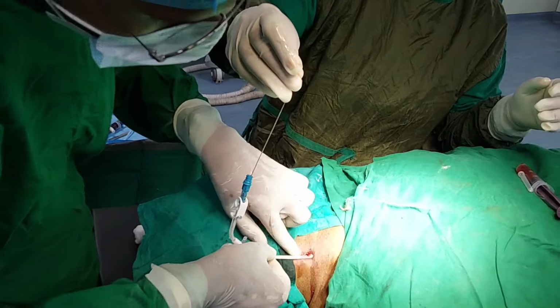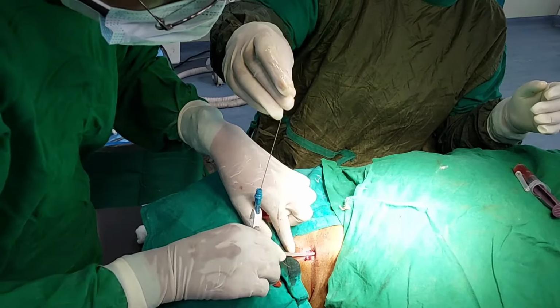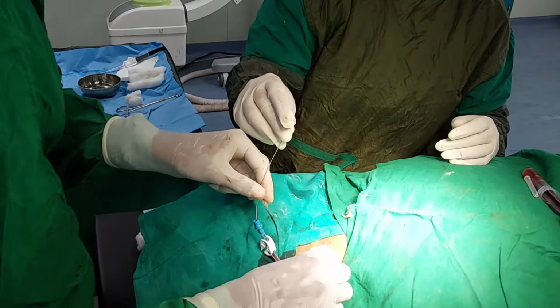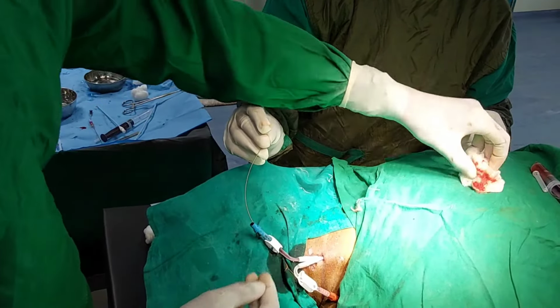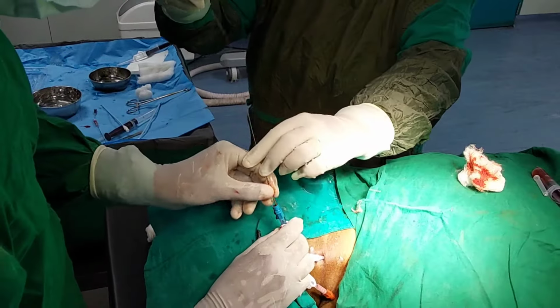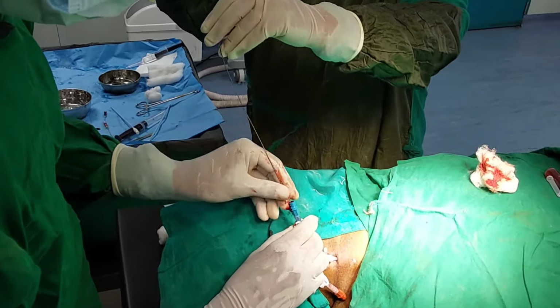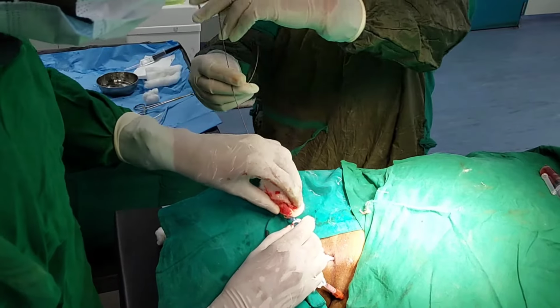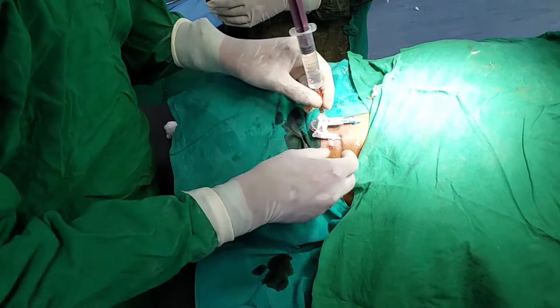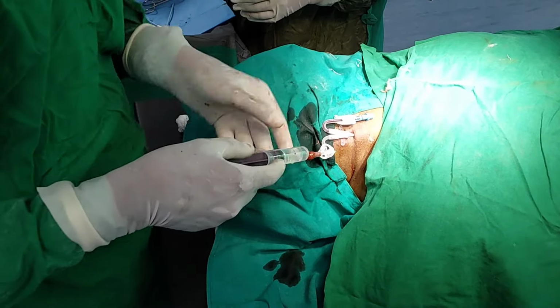Now just simply push the catheter inside and remove the guide wire. There should not be any resistance. It should go very easily. Then after this you have to check the patency of both lumens. See, this red color lumen is patent.